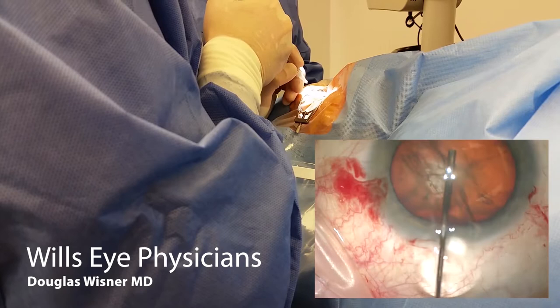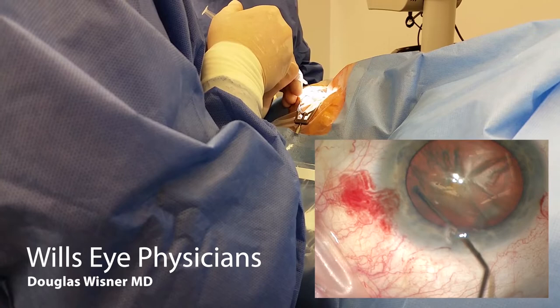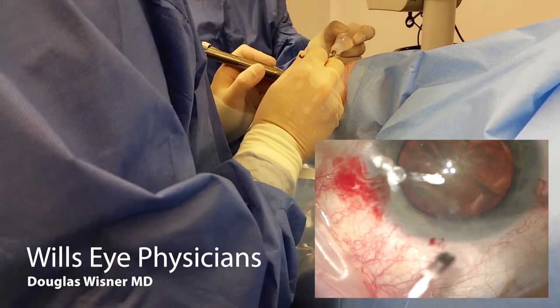Next step is hydrodissection. I use a flat hydrodissection cannula because I feel like it's a good seal. There's a fluid wave you just saw progress. I tap down on the lens, go to the other side, see some lens rise, push down again, then go peripheral and pull back towards the wound nice and slow. See the lens start to rotate. You've got to be peripheral in the endonuclear-epinuclear junction because you're trying to develop torque.